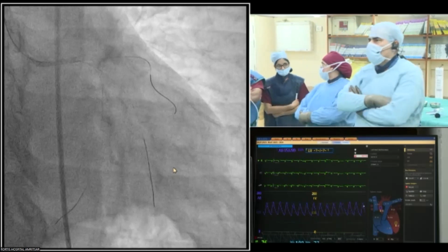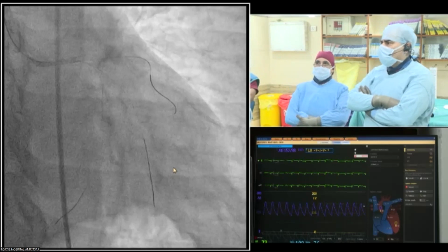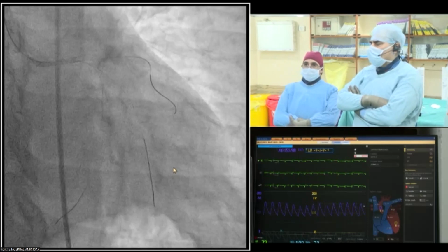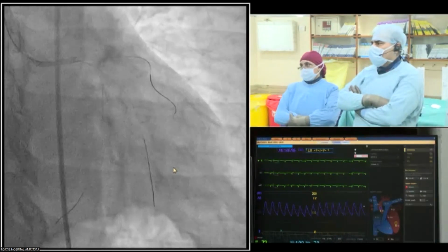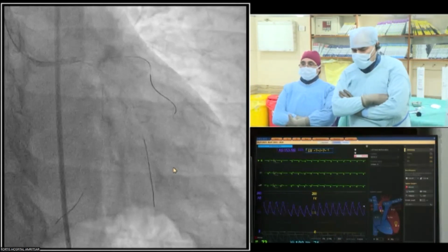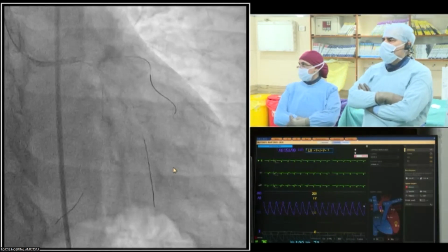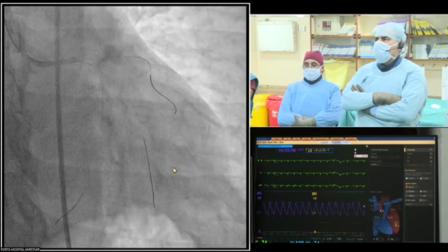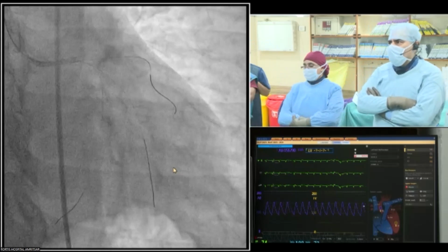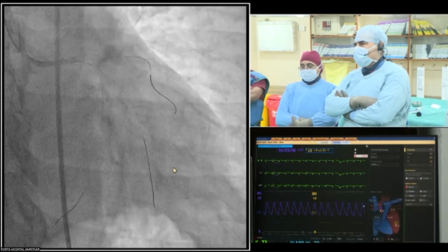So at one point, you are telling LAD stenting is okay, crossover is okay. In a circumflex ostial lesion, will you do a crossover from the LMCA to the circumflex and keep the LAD ostial pinching and all, creating confusion? Number one. Number two, actually what we have done is he did a balloon dilatation prior to the cutting balloon. Did it create more dissection, rather than the cutting balloon alone, which would have been better? This is my question. I'm not sure that I can tell prospectively or retrospectively. Of course, retrospectively it's easy. Prospectively, I'm not really sure. I think it was a reasonable strategy.